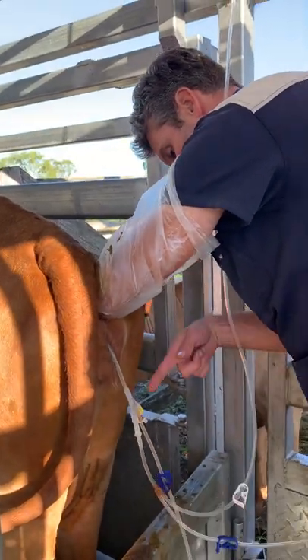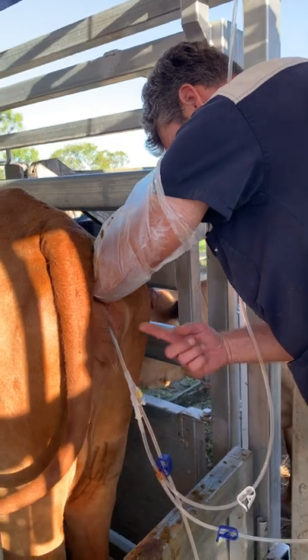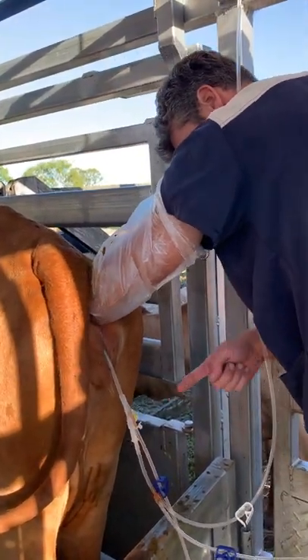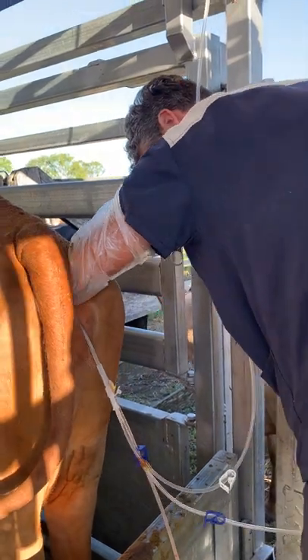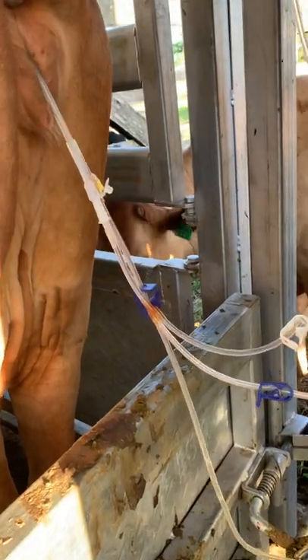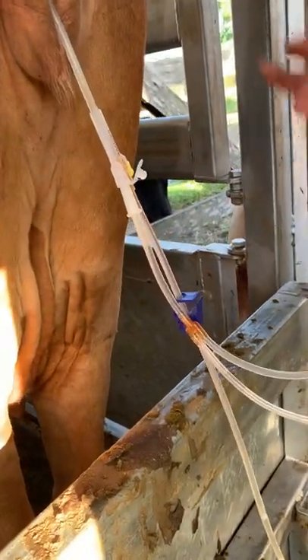Now I've just opened the fluid running in, it'll fill up the uterus and then the mucus and content will come out. So this first bit here now, that's most of the embryos coming out right there. And that little bit there especially, and then that first tube.